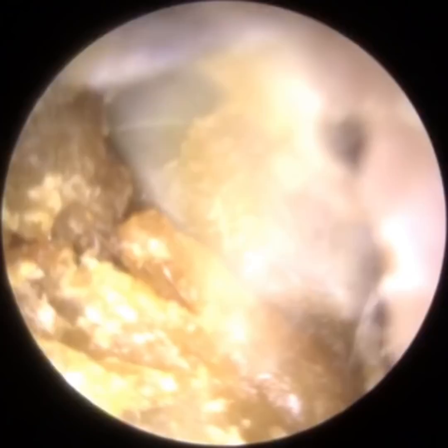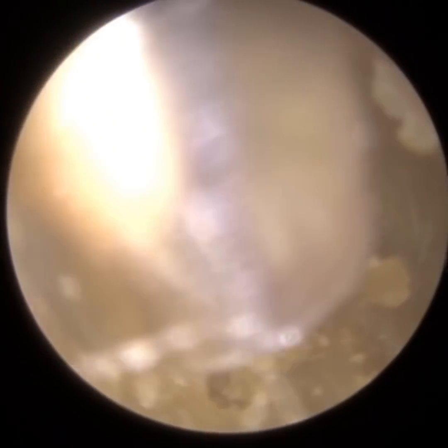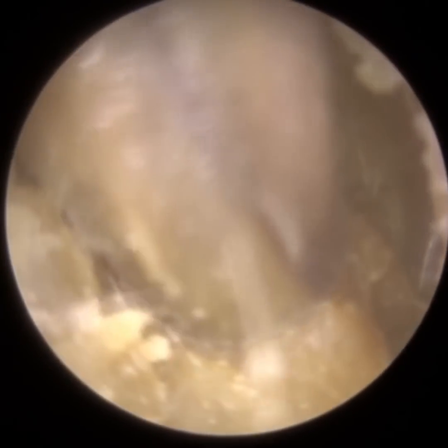The reason for that is that they got water in their left ear, and they're fully aware that they should avoid water in the ear. But unfortunately, they did get water in the ear, which caused their otitis externa to exacerbate in the left ear. You'll see in a moment, when we've done the right ear and we do the left, that the entrance of the ear is extremely tender and inflamed.